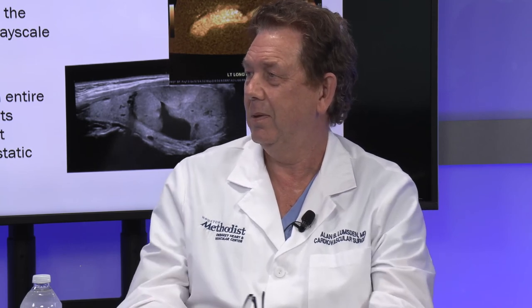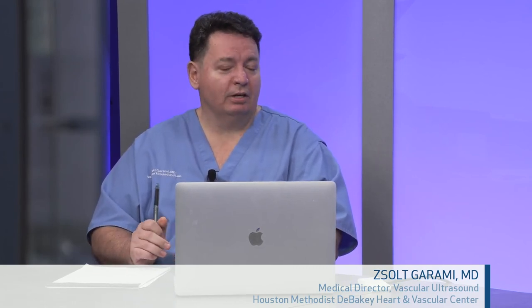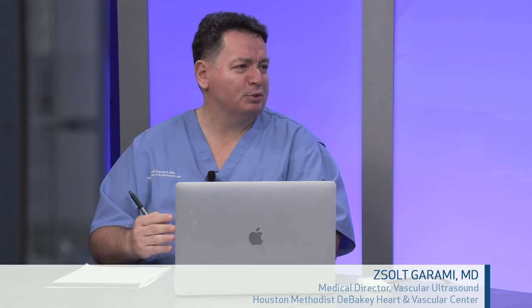I believe so, and we do have a protocol. We are really proud that our ultrasound is always right. A few times we already demonstrated that when MRI or CT showed occlusion and ultrasound showed an open vessel, we confirmed with angiogram. These are really about patient care, when you're relying on that tiny change of head position, for example, that makes the vessel open or close.